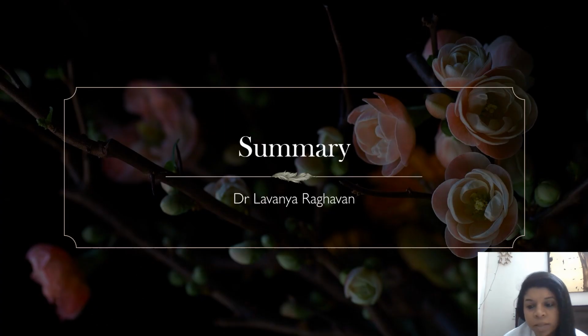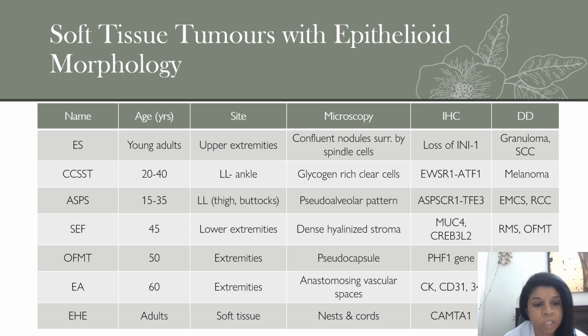So we'll just summarize the things which we studied today. We studied 7 tumors. In that, epithelioid sarcoma is usually seen in young adults in the upper extremities. They show confluent epithelioid nodules surrounded by spindle cells which can mimic granuloma or maybe non-keratinizing squamous cell carcinoma, and characteristically they have loss of INI1 in IHC.